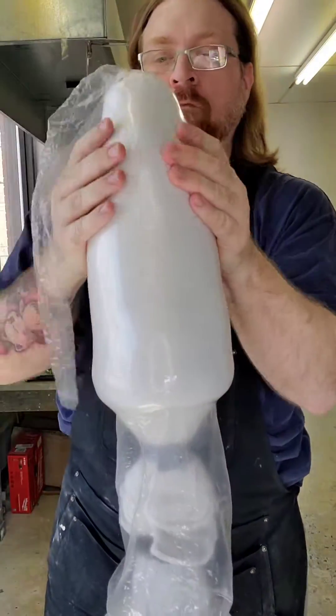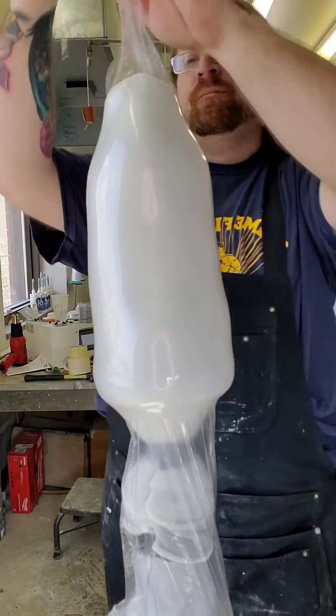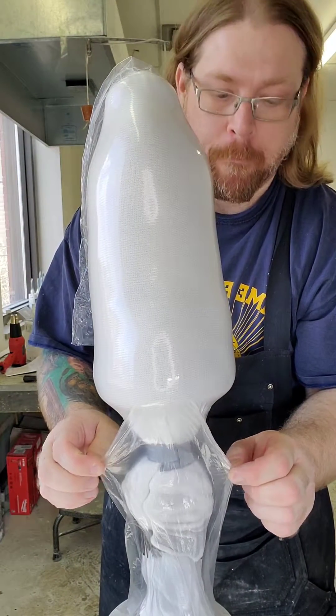So now I just slowly work it down the mold, making sure I get all the wrinkles out. Then we apply a vacuum and it's ready for resin.